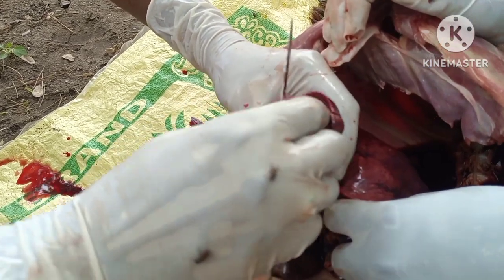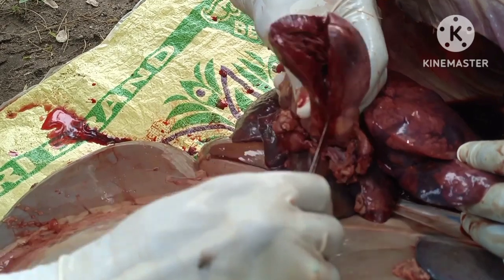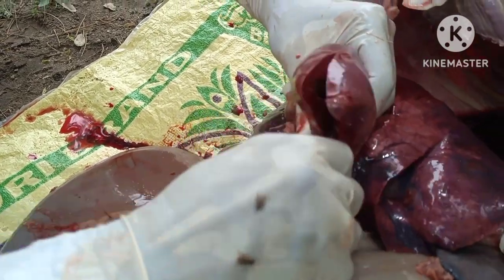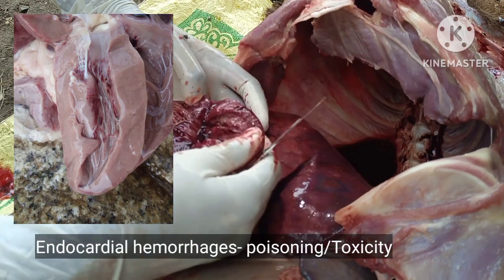and observe if there are any abnormal blood clots within the heart chambers, or if there are any petechial hemorrhages on the endocardial walls.